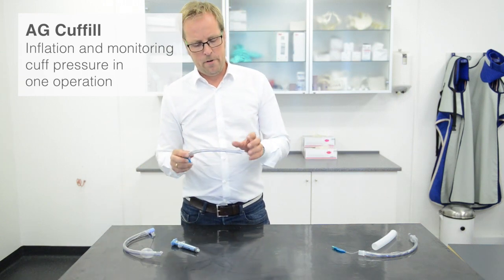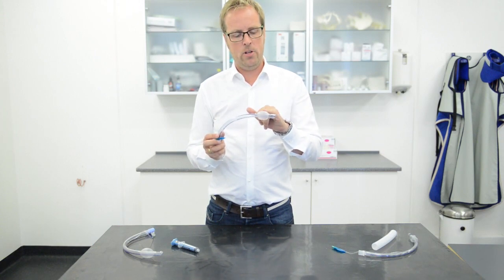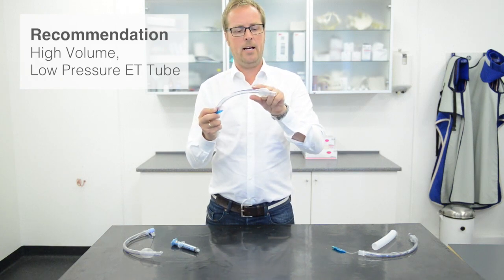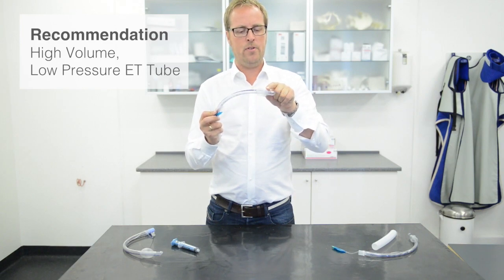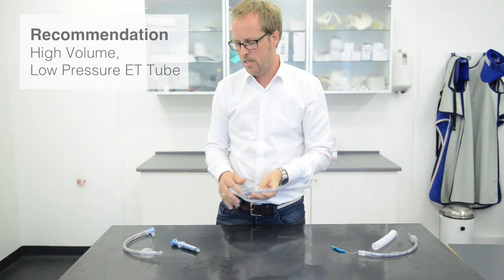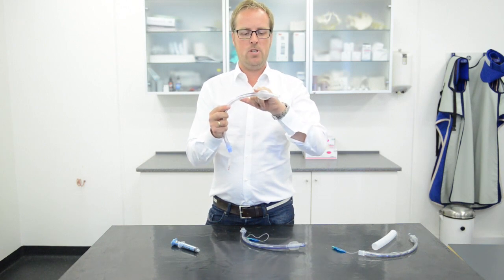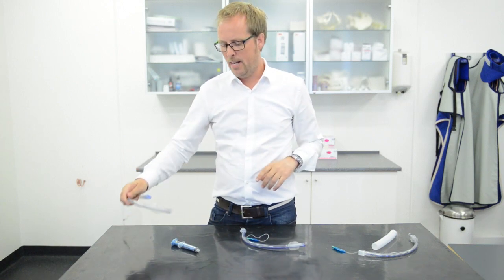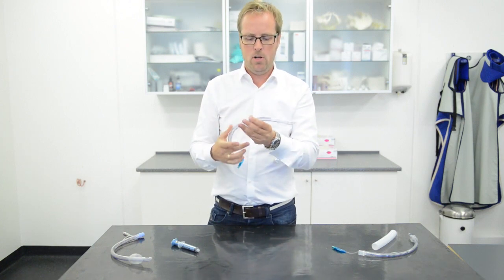First of all, you take an ET tube — we recommend a high volume low pressure cuff, which you can see is shaped a little bit like a barrel, so it has a very long linear surface where the pressure is spread over a wide distance. Compared to what is also available, the olive-shaped cuff, which is low volume high pressure where the pressure is at a very small surface point — that can lead to complications. So definitely make sure you get the high volume low pressure cuff.